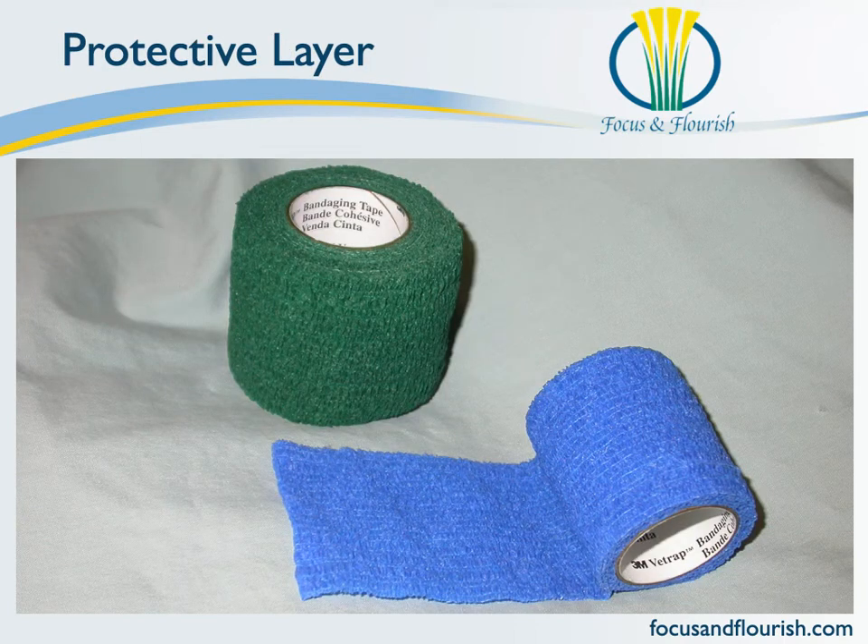Your final layer is going to be that self-adhesive cohesive wrap style material — such as Vet Wrap here, but Koban is another brand we're familiar with. Whatever brand you use, this layer is going to serve to protect your bandage. It's going to keep your bandage a little cleaner, help the cling maintain its shape, and it's also going to offer some water resistance properties for your bandage. Not waterproof — let's make that clear — but water resistant, which is just going to help this bandage go a little bit further.